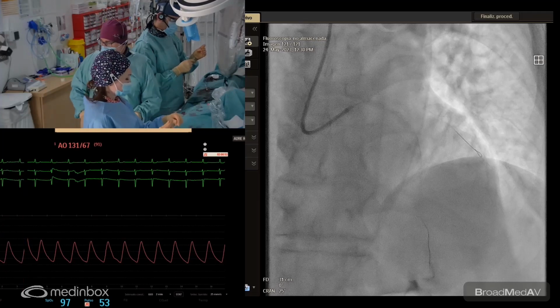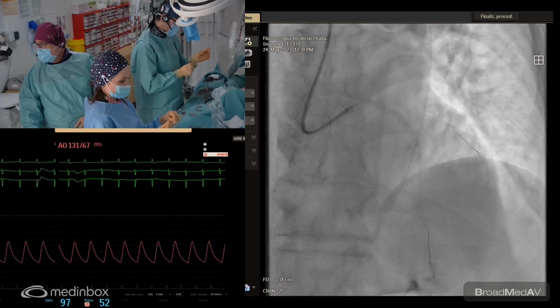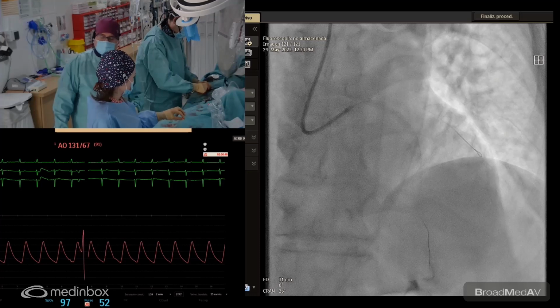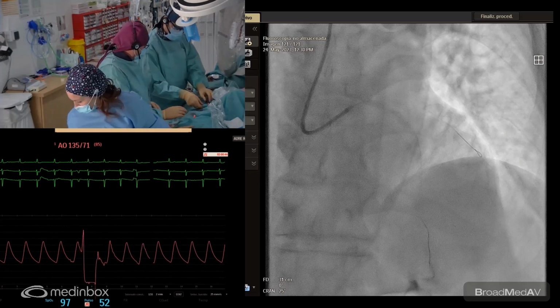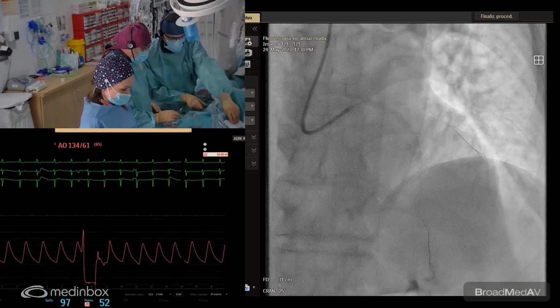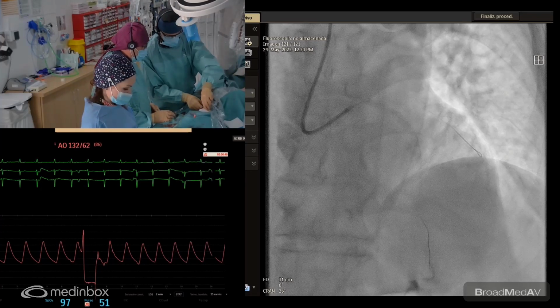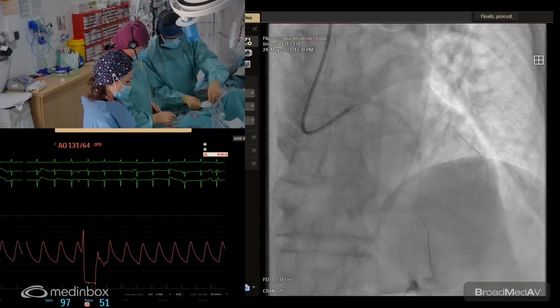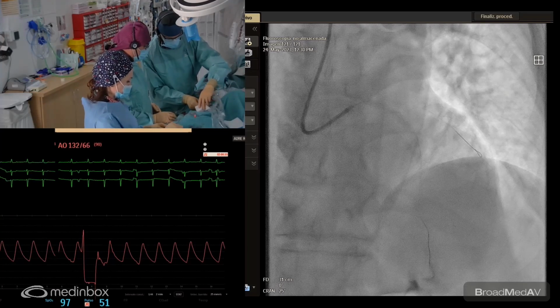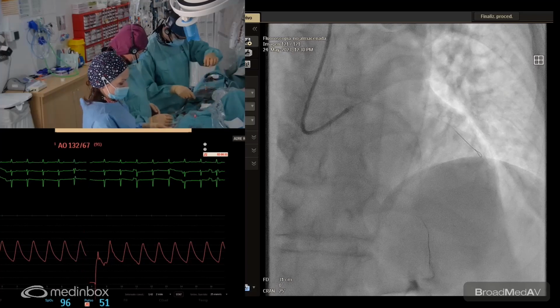Y vamos a un test de momento, ¿no? Un test no compliante primero y ya si acaso abajo. Un 3 no compliante, ¿no? 3.0 non-compliant. 3.0 non-compliant. So this is the diagonal. 15, yo creo que está bien, sí.